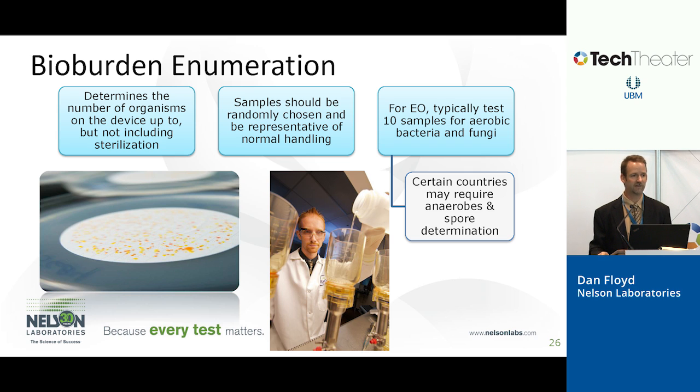If you have any water steps where maybe there's a cleaning process, if that's allowed to sit wet, a lot of microorganisms, if there's water present, will start to reproduce and can actually increase on the product. So water is always a red flag. A lot of the organisms that live in water can also cause endotoxin problems. And so bioburden is a step that you do with ethylene oxide sterilization, just like you do with all other types of sterilization. But it's not quite as critical as it is with radiation.